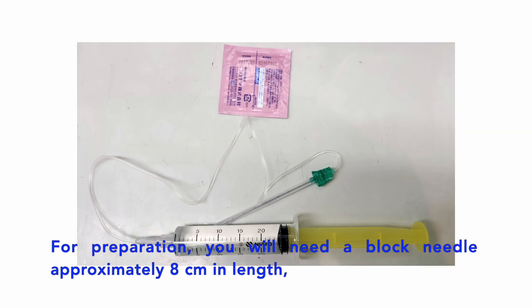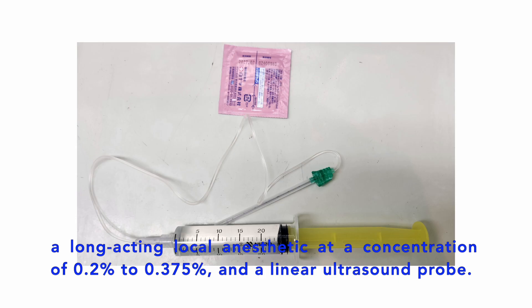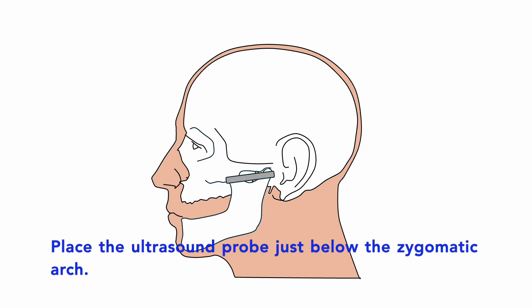For preparation, you will need a block needle approximately eight centimeters in length, a long-acting local anesthetic at a concentration of 0.2 percent to 0.375 percent, and a linear ultrasound probe. Place the ultrasound probe just below the zygomatic arch.